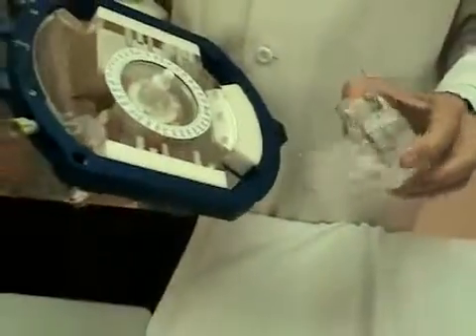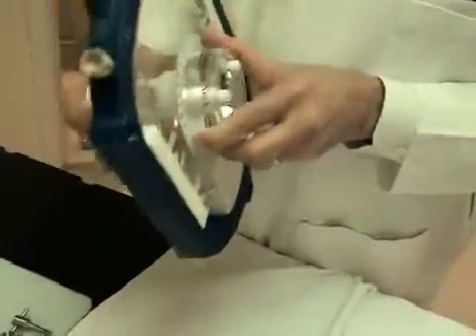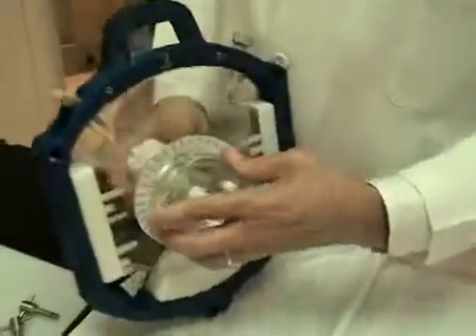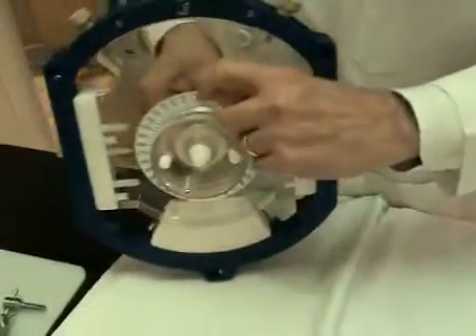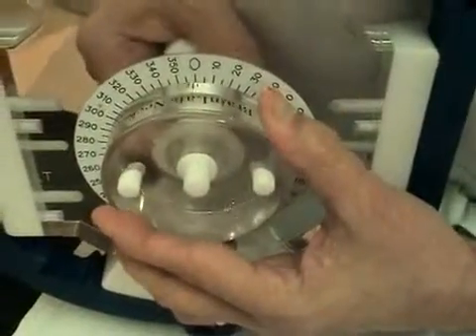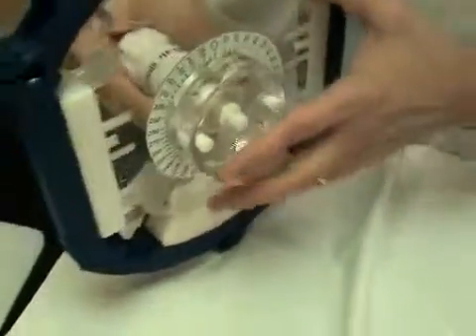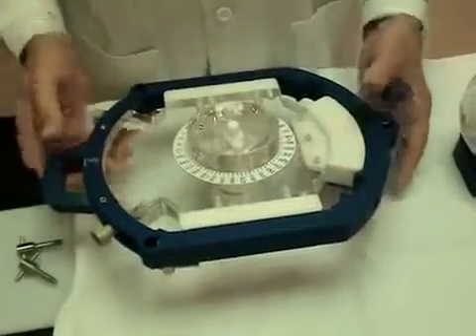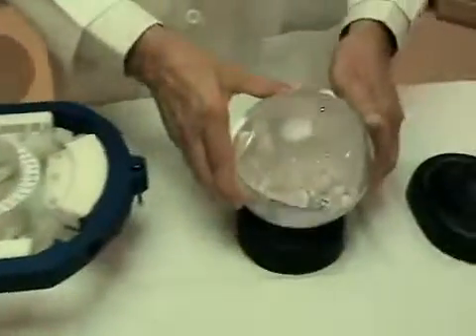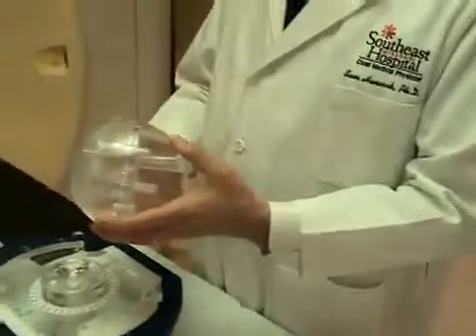The BrainLab neck goes on like this. There's a little mark here that you can use to set your angulation. And now at this point, you have to decide what orientation you want your volume insert to be.